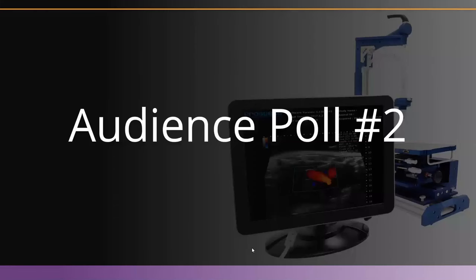Okay, so now I'm going to turn it back over to Martin for a second poll of the audience. Thank you very much, Tanya. And I think that was a great start to the webinar. I'm hoping everyone is enjoying the presentation so far. We actually have had quite a few questions come in already, which is great. And please do continue to send them along. We'll get them answered after our presentation.